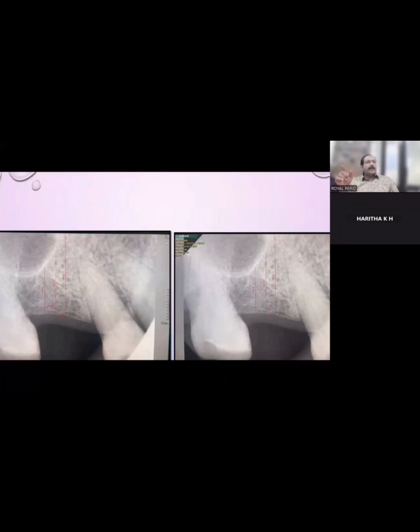What density do you expect in this case? That was a tooth that is being extracted for mobility reason, not because of dental caries. It was mobile. So seeing the trabecular pattern and the history of being extracted for periodontal reasons, the density will definitely be less. It will not be as dense as any other region. So it can't be in the D1, D2 region. It could be D3 or even D2, D3, but definitely not a very thick one.